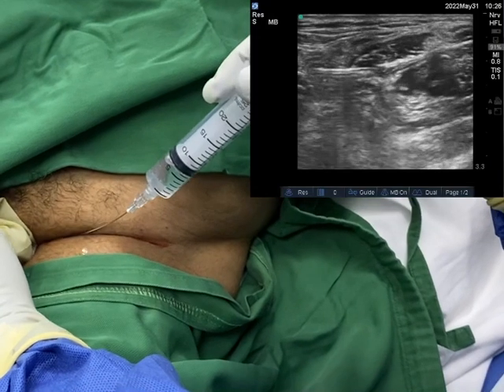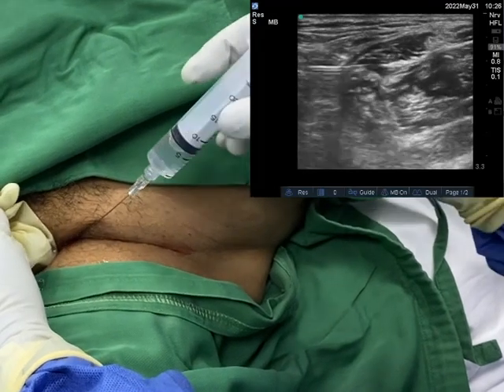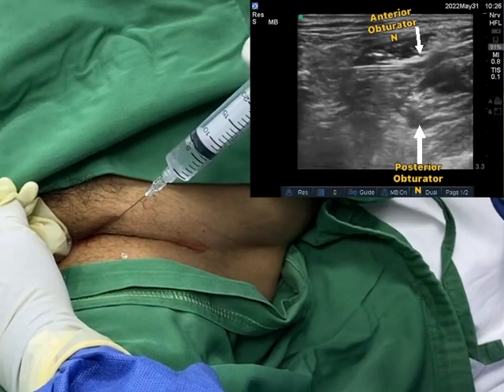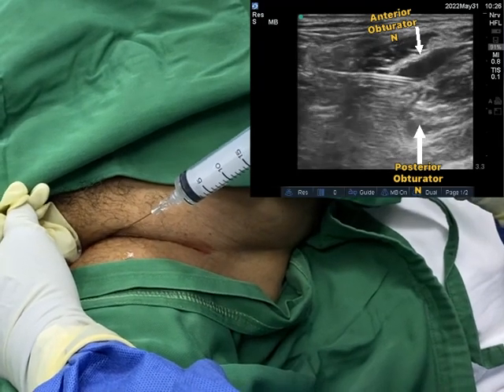For the next plane block, you don't have to take the needle out — you just have to redirect it superficially towards the plane between the adductor longus and the adductor brevis muscle. That's the spread of the local anesthetic between the muscles.